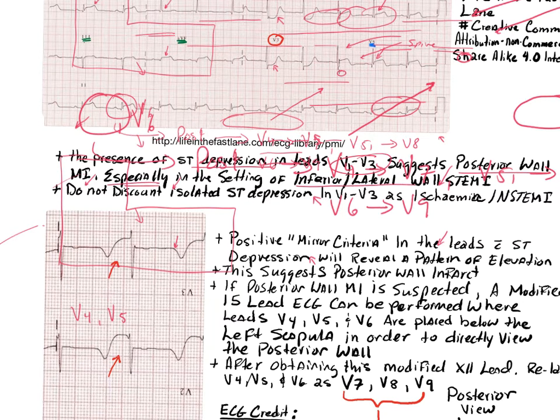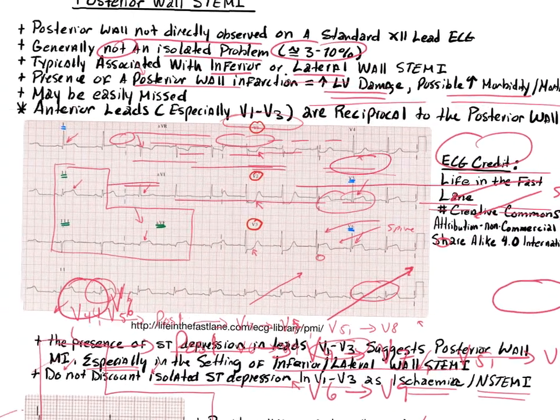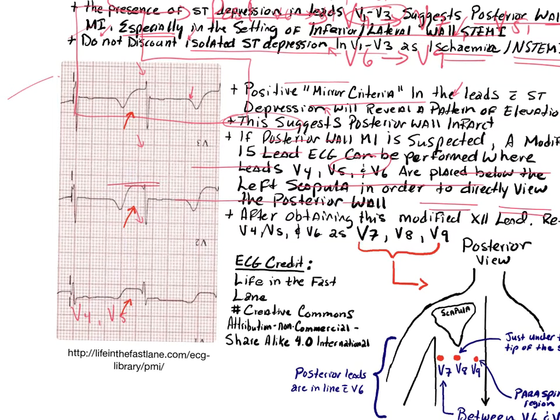Do not discount ST depression in V1 through V3 as just ischemia or a non-STEMI, especially in the setting of an inferior or lateral wall STEMI. When we flip and enlarge those leads and apply the mirror test, what was depression now looks like massive ST elevation — a positive mirror test confirming posterior wall infarct.